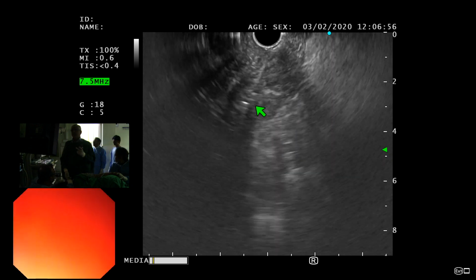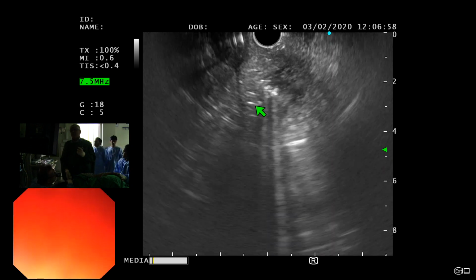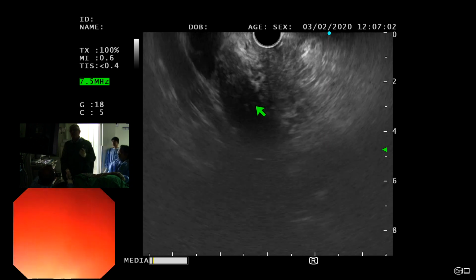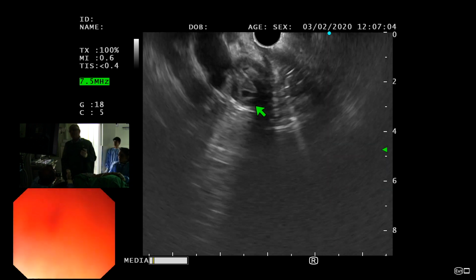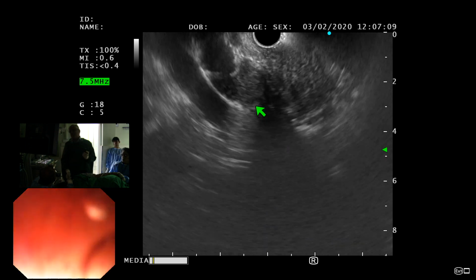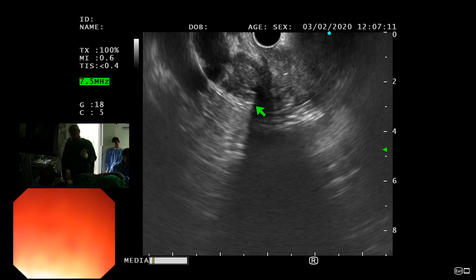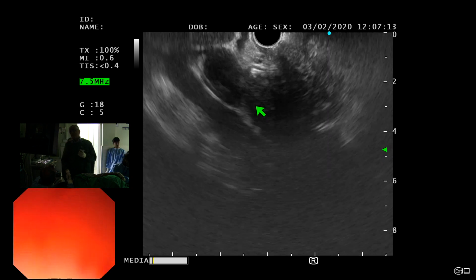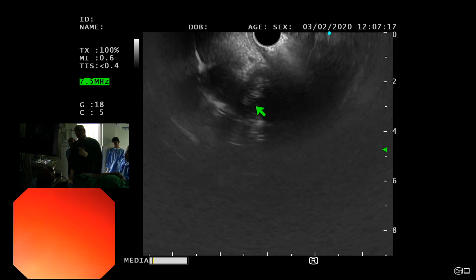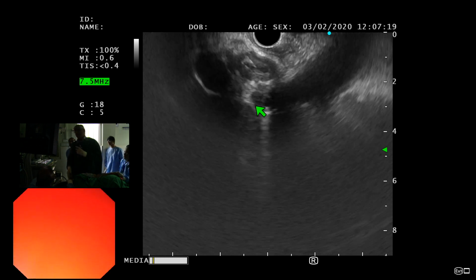The second one I'm waiting. Can you see the stent now all the way here? I don't know why, but we lose the actual white lines as we come here, probably because it's just a little bit of a tangential image. It probably moves away from you. That's probably what was happening. I've tried different things. That's the best that I'm getting.